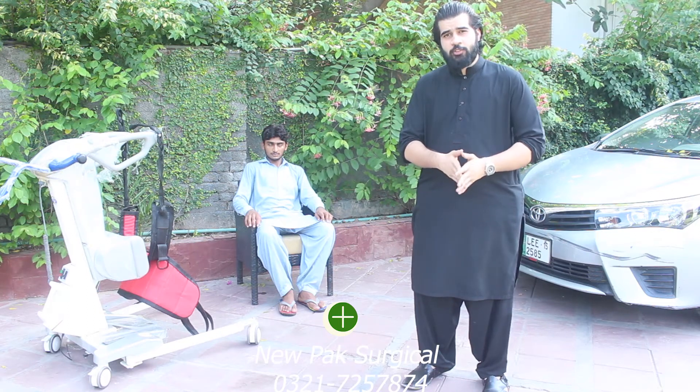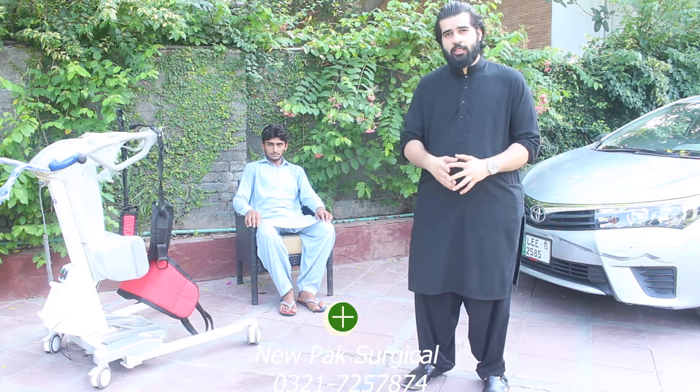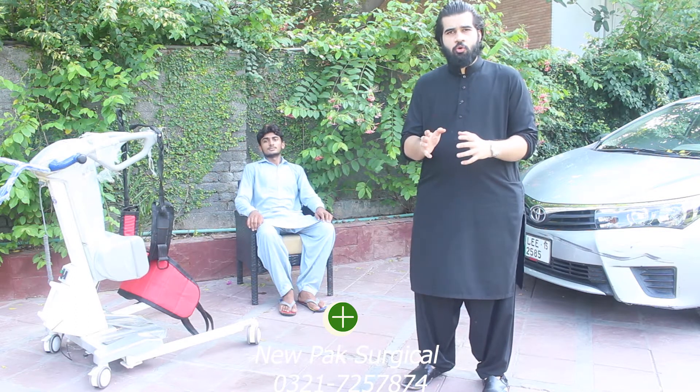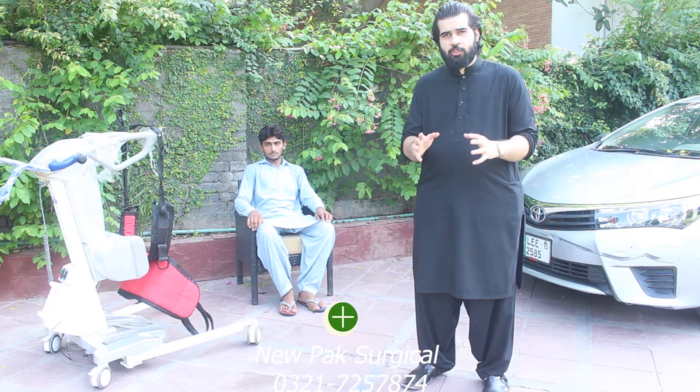Hello, my name is Abbas. I am from New Park Surgicals. Today we have a patient lifter. There were many queries online about whether we can use this patient lifter to transfer the patient to the car. There are other questions that I will answer today.